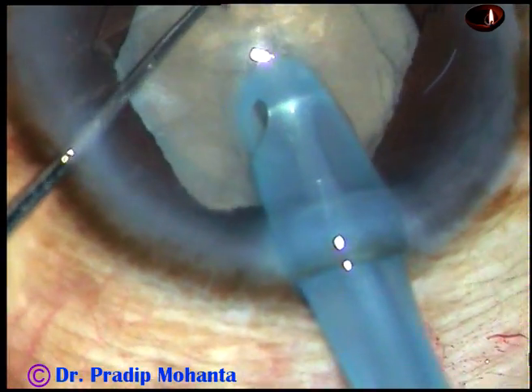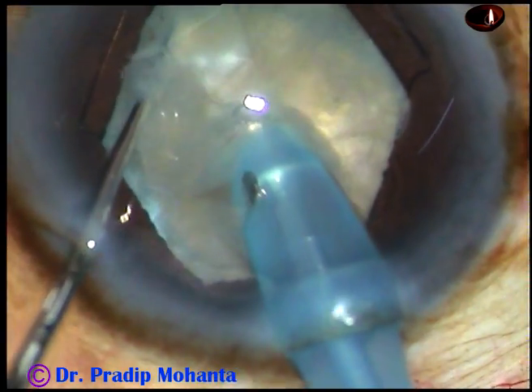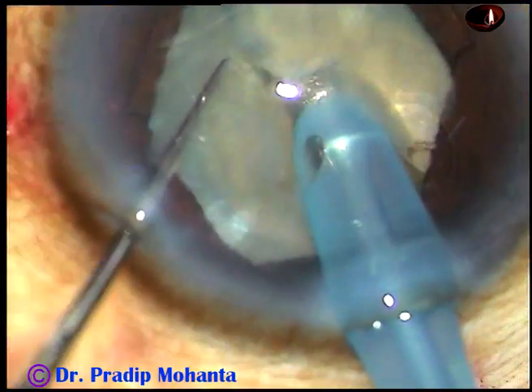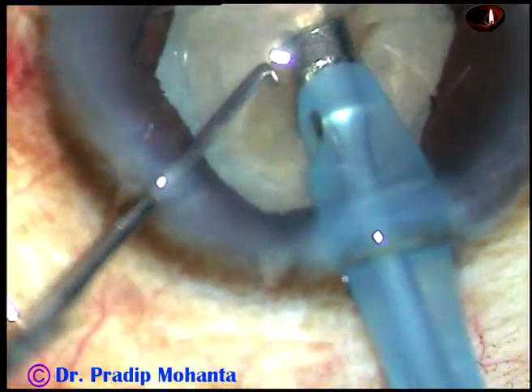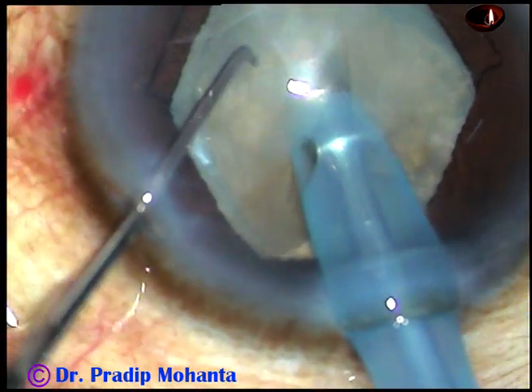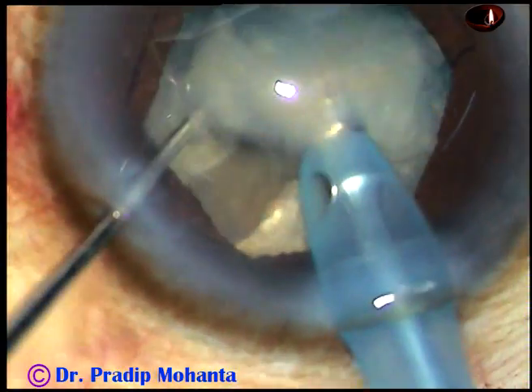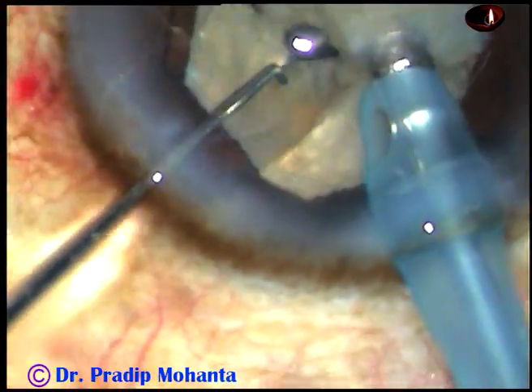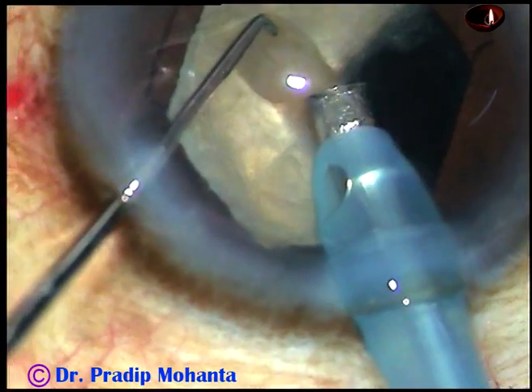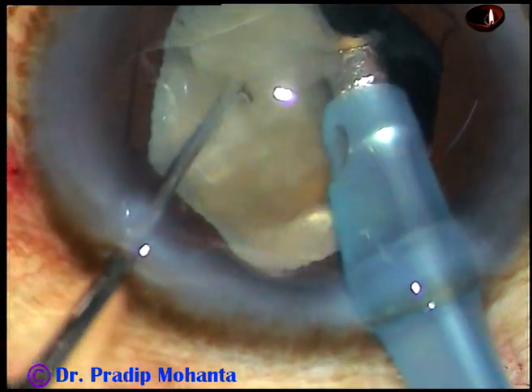Bury the tip completely into the substance of the nucleus and try to chop. Yes, I have got a good crack. Rotate it again, go into the substance, hold it very firmly and make another chop. This free nuclear fragment is being emulsified and removed. And this is another chop.